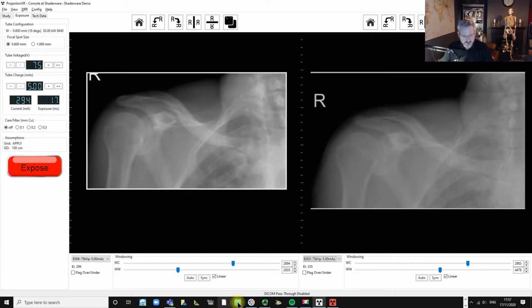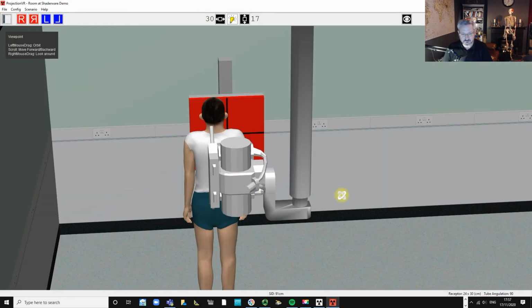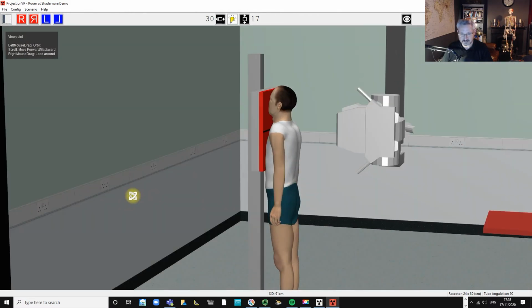Now we'll try the, it's called a half axial projection, but the angled projection. We all know that axial means for it to be an axial projection, then the receptor would have to be in the axial plane, and it isn't. It's in the coronal plane here, or parallel to the patient's coronal plane, I should say.